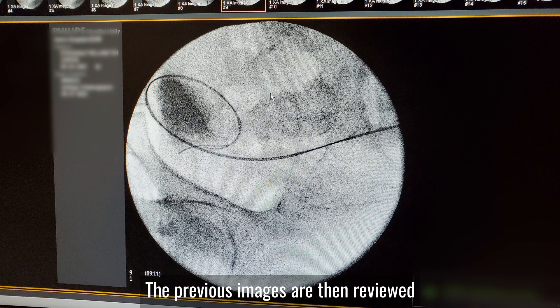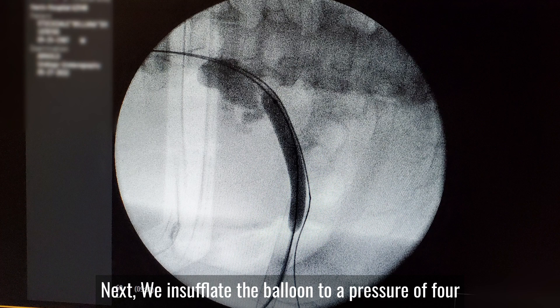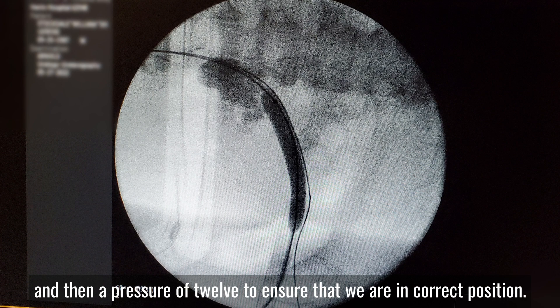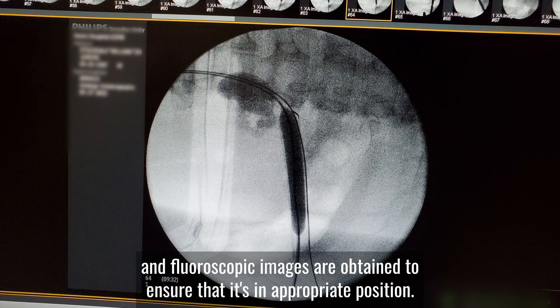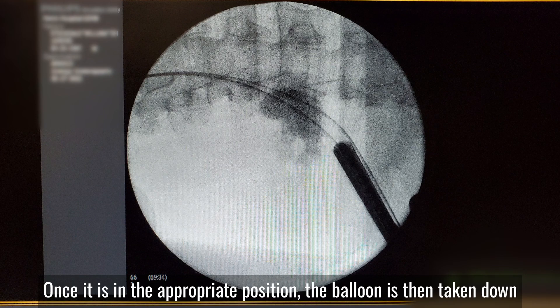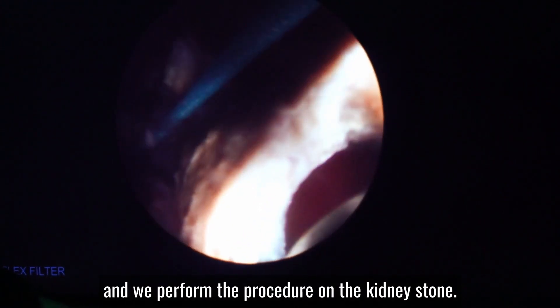The previous images are reviewed and the dilation balloon is placed just inside the appropriate calyx. We then insufflate the balloon to a pressure of 4 and take a fluoroscopic image, then to a pressure of 12 to ensure correct position. The access sheath is placed over the balloon with fluoroscopic confirmation, the balloon is taken down, and a rigid nephroscope is placed via the sheath into the kidney to perform the procedure.